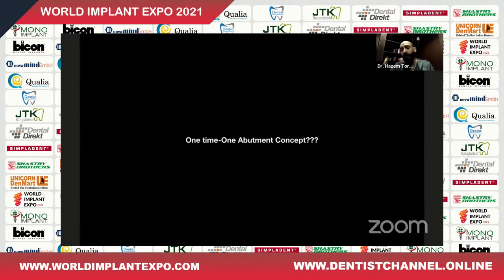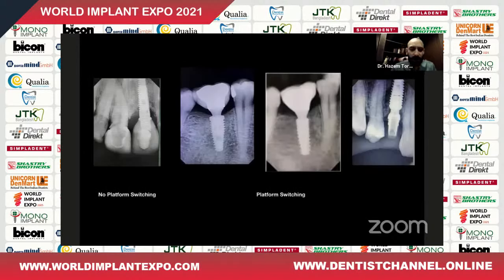Now, we all heard about the one-time, one abutment concept and how there's a lot of controversy about what will happen if we remove the abutment, place the healing abutment, take an impression, and remove the components in and out of the implant. Some studies say it can cause recession and crestal bone loss. Some studies say it doesn't have a big effect, but logically we can think about it, and some histological studies have shown that the moment we are able to place an abutment and just leave it there, not to interrupt the peri-implant environment, it's an option that we can do, so why interrupt this attachment?